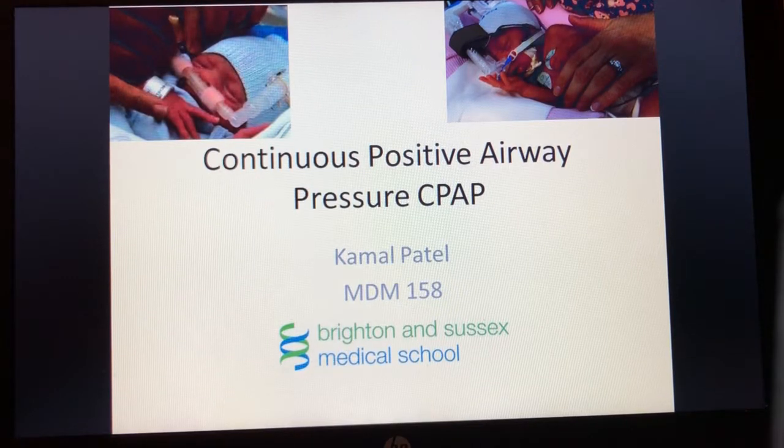And the benefit and advantage of this is that it can be used also in the third world, and there are emerging studies being published of the use of bubble CPAP because it's low tech in third world countries, so Pakistan and in Africa, in the treatment of respiratory failure in children and not just premature neonates.